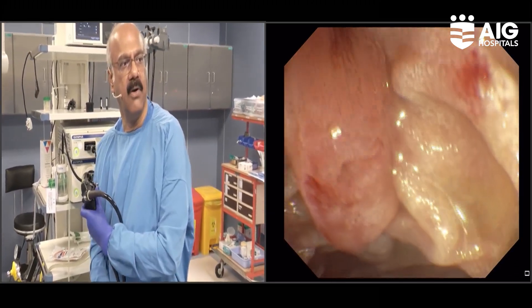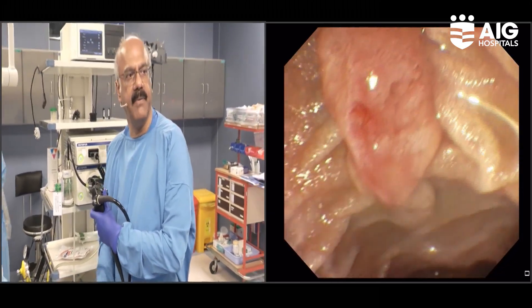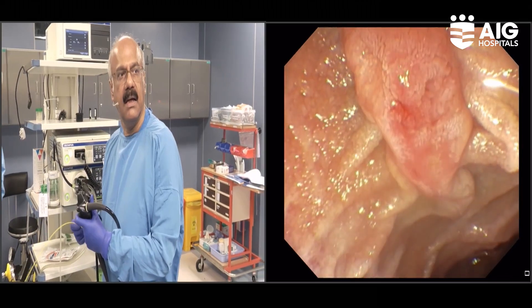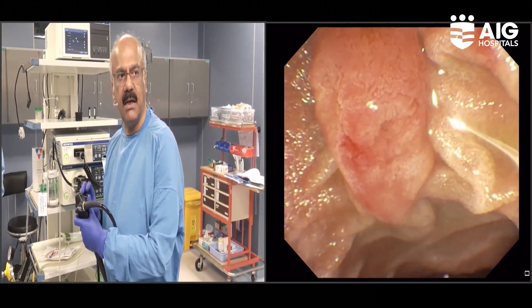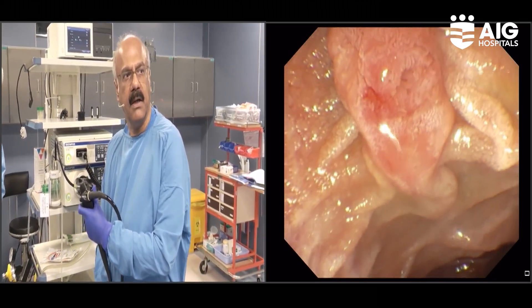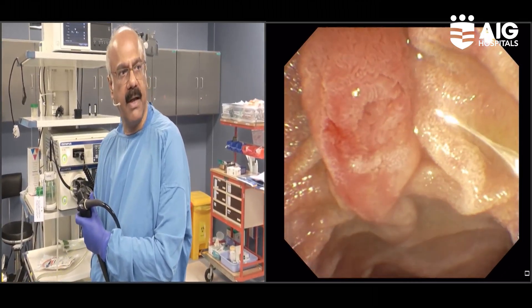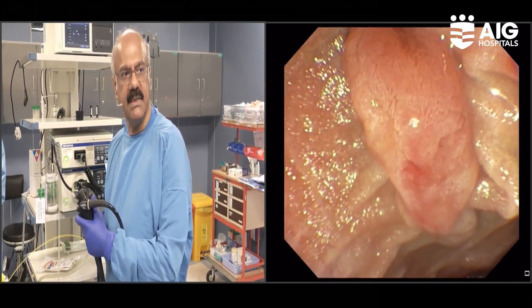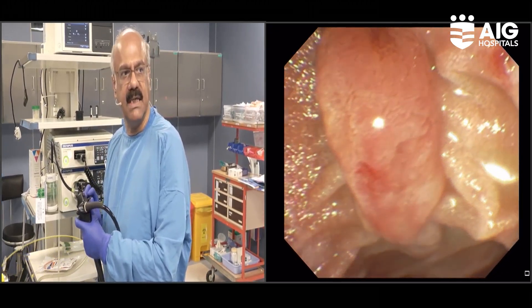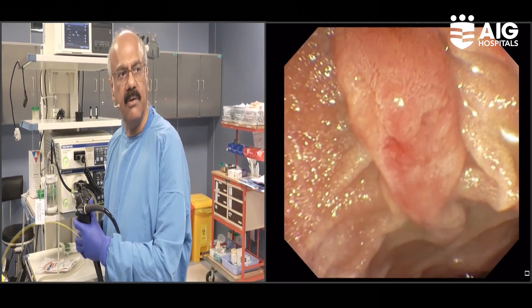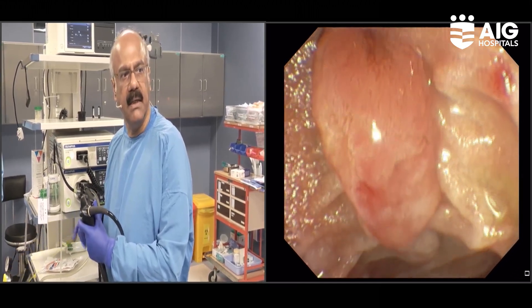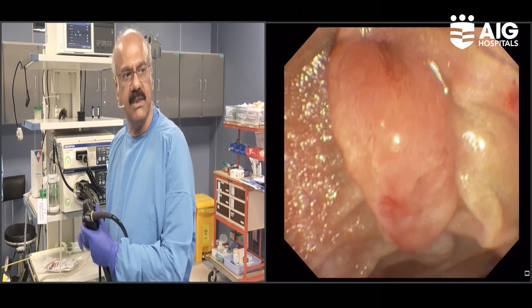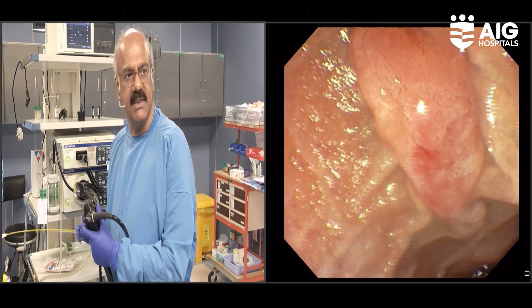What I'm going to do is take pathology biopsies from this papilla, and then subject this to a VivaScope confocal microscopy to see what the pathology is. The reason why this is important is that if I see a benign lesion here, I could even think of doing an ampullectomy directly, or if it's uncertain, could put in stents.